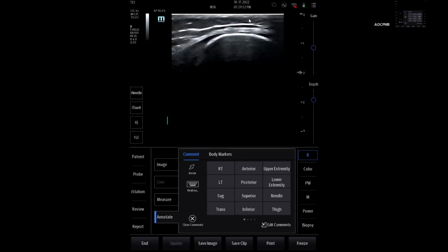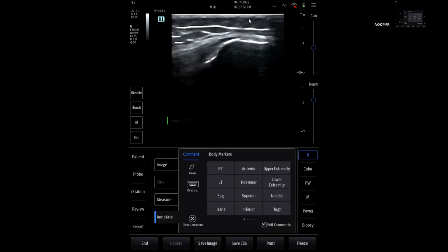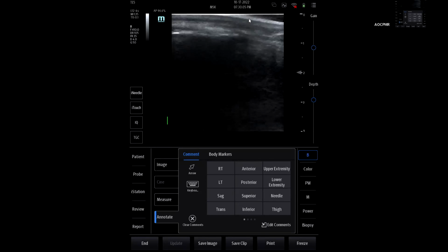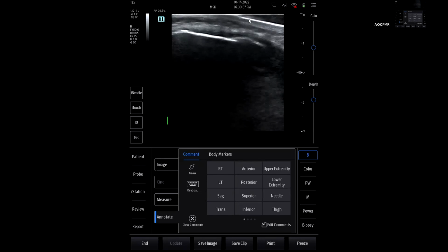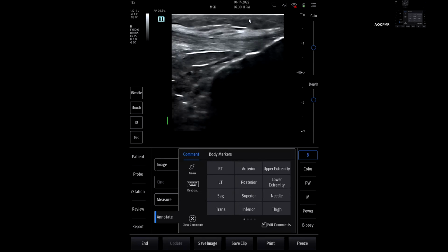I can scan up over top the knee. You see how little tissue is there? You can see the fascial continuation going across, the continuity of fibers between the quadriceps tendon and eventually going to the patellar tendon. So moving inferiorly over top the patella until we get to the patellar tendon, with on this side, you see the tibia on the very right side of the screen.